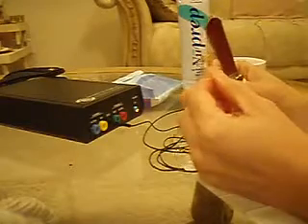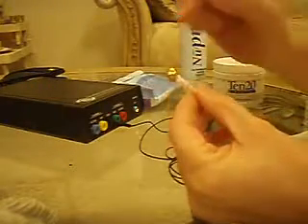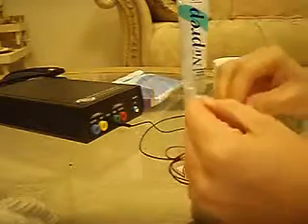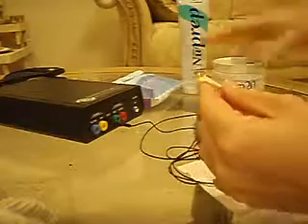When preparing electrodes for either EEG biofeedback or for QEEGs, you're typically going to have one of two types of electrodes. One is going to be cup-shaped with a hole in the center. The other type is going to be just a flat disc. Either way, you're going to prepare and clean them basically in the same way.